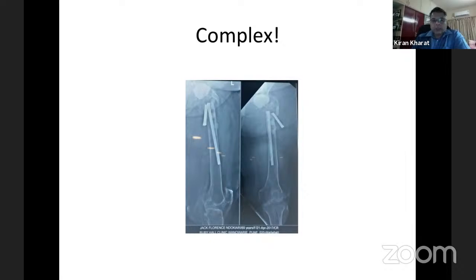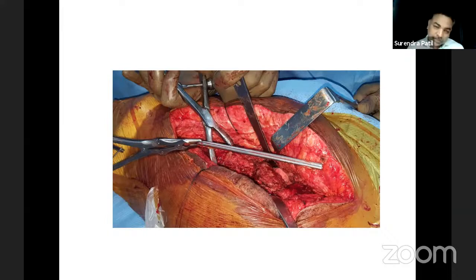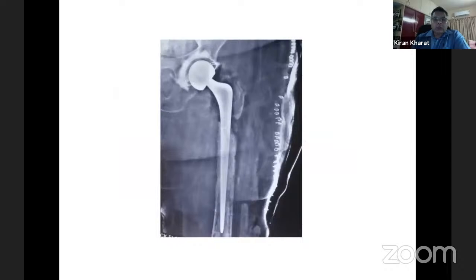So in this particular case, when I went in, it was really looking very good, no infection at all. And the soft tissues were really adhered to each other. So I just went straight down onto the bone and developed good flaps and did a thorough removal of all the broken implants. And this is what I managed to put in. So long stem revision with antibiotic cement and a cemented rim fit Exeter cup.